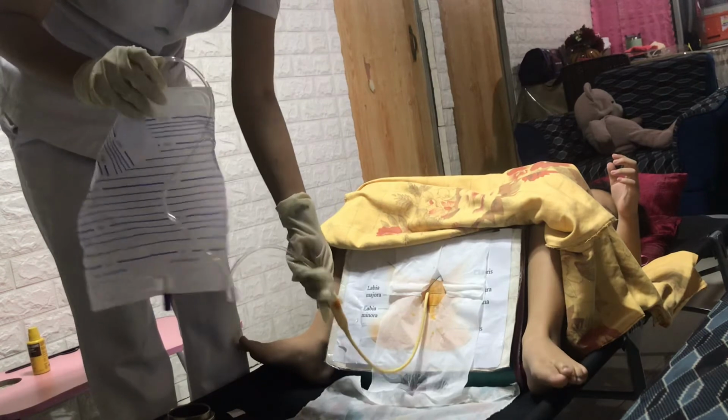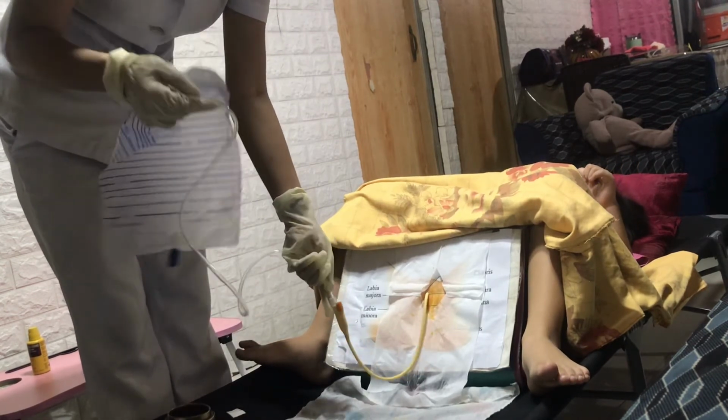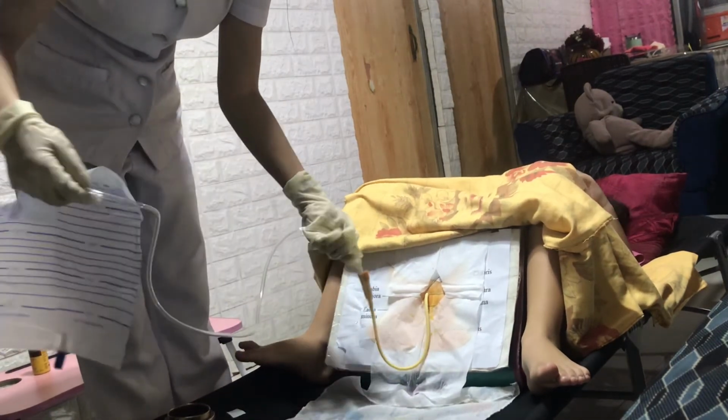Next, after we attach the urobag, we need to attach the catheter to one leg with adhesive tape.